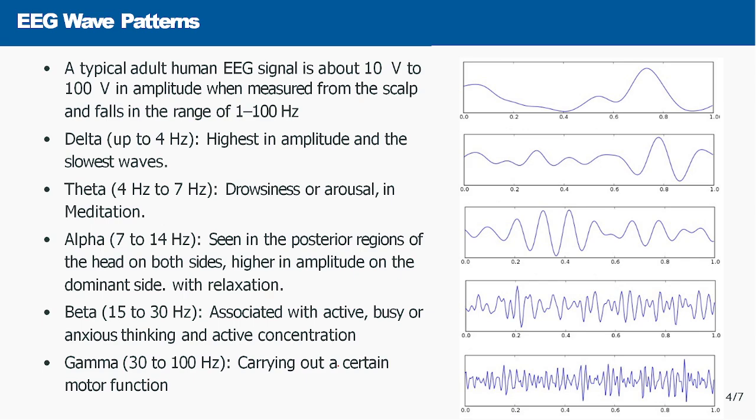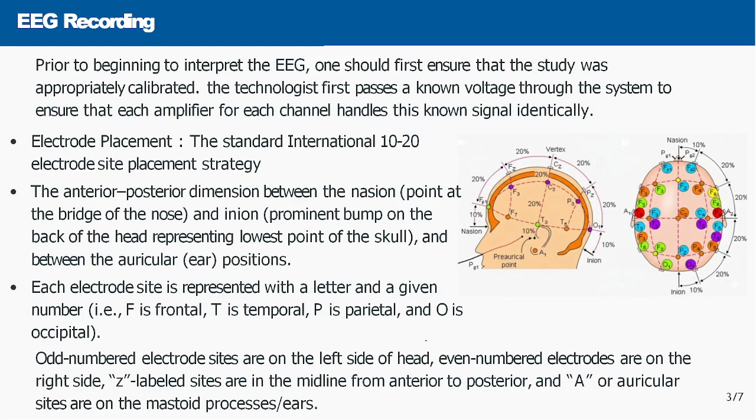Now, considering different electrodes as I have discussed, let's say from F3 we take one signal, and from T6 we take another signal. These two electrodes record two different signals, and their difference is then amplified through the amplifier or pre-amplifier.